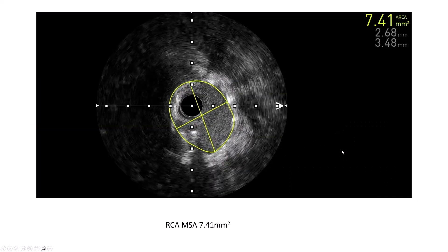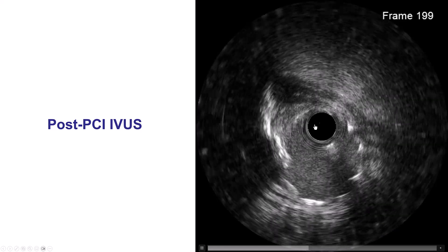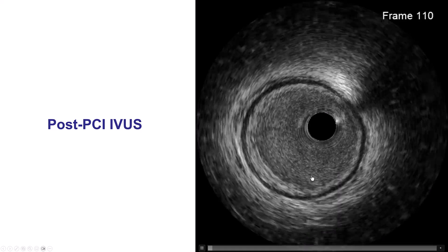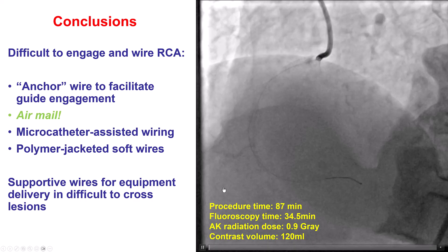We had a nice final result. The final IVUS showed good stent expansion, with the stent extending all the way into the aorta. The minimum lumen area was 7.4 mm², which is pretty good.